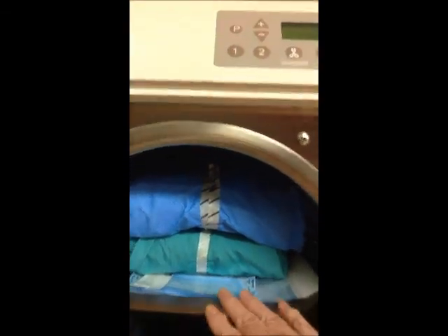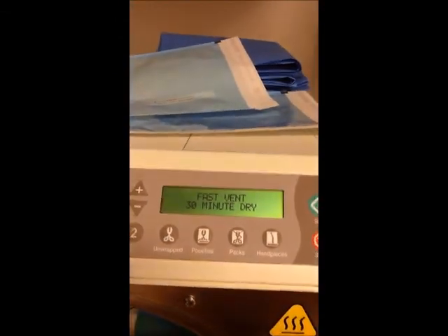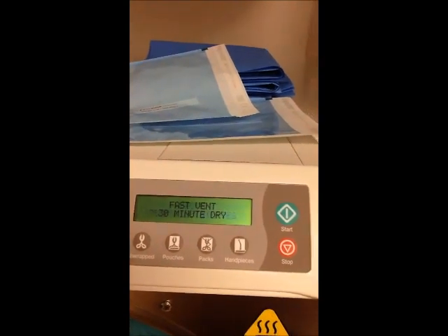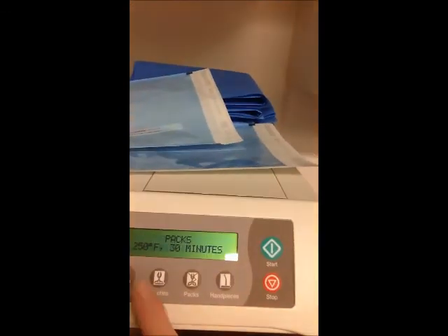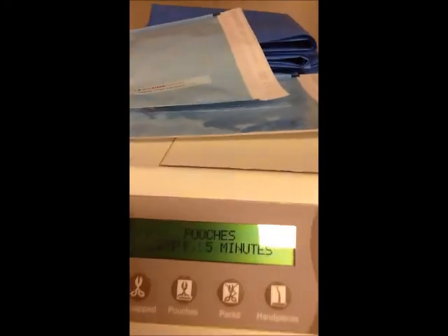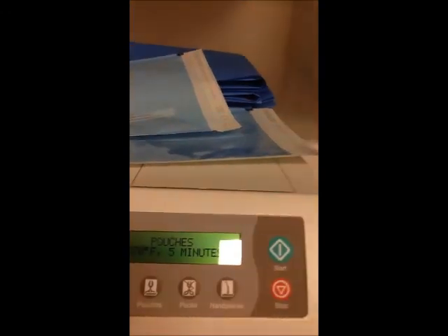You can add some instruments in the front here. There's still a little bit of room, and then you'd come up here and if you were picking packs, you would have 250 degrees. It would be pressurized for 30 minutes. And then you would have a 30-minute vent dry. If you were just doing the pouches, that's these without any of the packs, you would have 270 degrees for about 5 minutes with a 30-minute dry time.